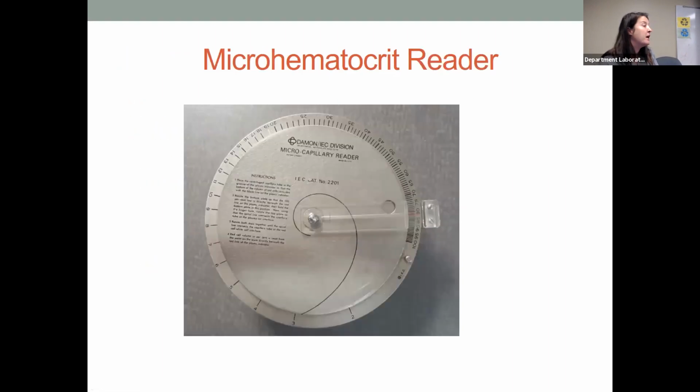All right, so that's your manual hematocrit. Most oftentimes, if there's any discrepancy between your hemoglobin and hematocrit, you might have to do a manual hematocrit. You probably will do this if you start working in the clin lab at some point. You'll probably do one of these.